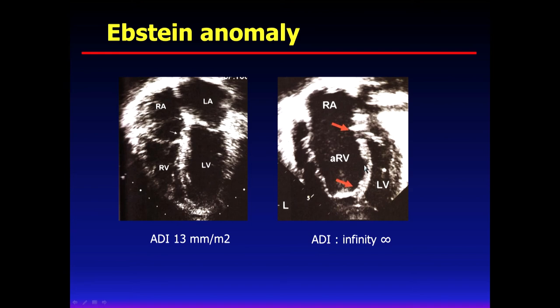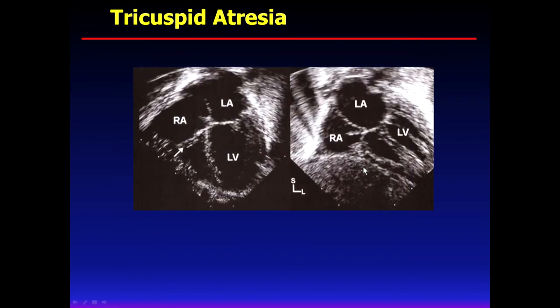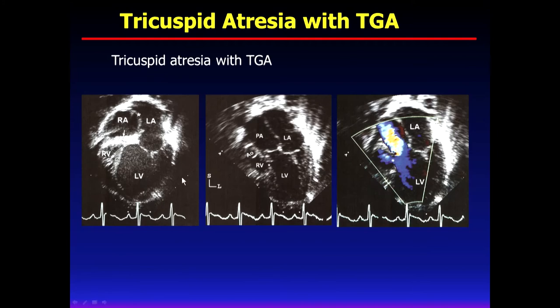But with this kind of ventricle, we cannot save the RV. And tricuspid atresia is the same problem about the RV. This is a thickened tricuspid valve, you can notice. And then this time, thickened tricuspid atresia. And the interesting thing is the great vessels.